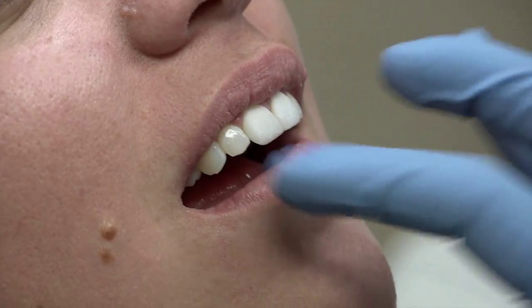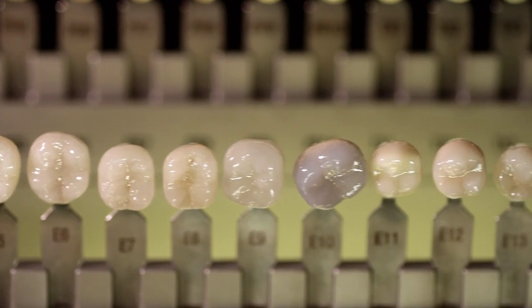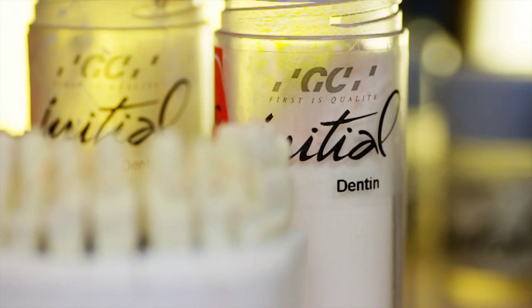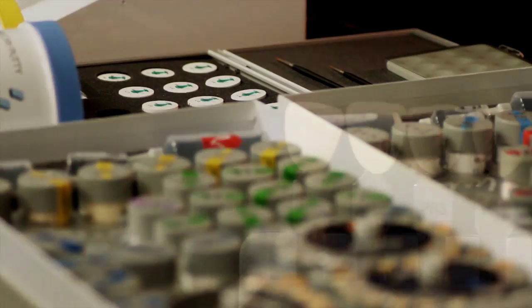Implementing the Seasons of Life shading system in your practice can make your time more profitable. There is less frustration. There is less hesitation. There is less guesswork and more confidence in yourself. You are left with beautiful, lifelike restorative pieces, and your patient confidently walks away with a smile that is aesthetically appealing and natural.